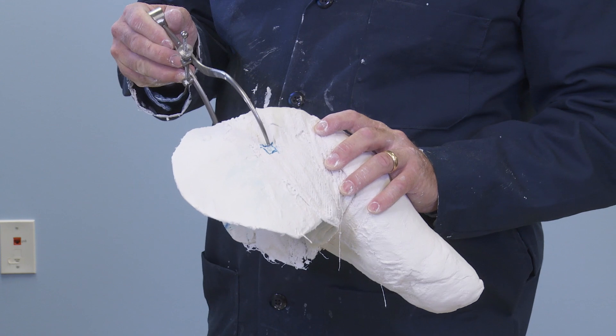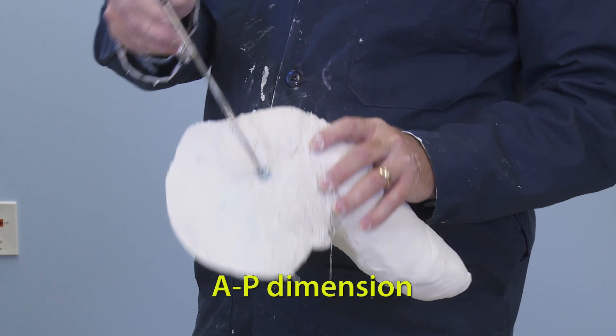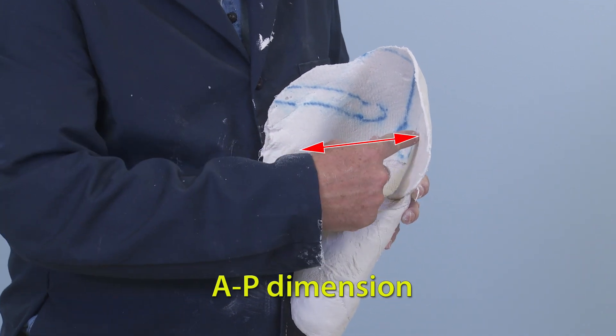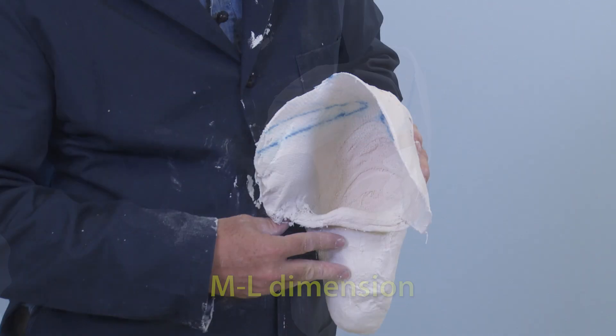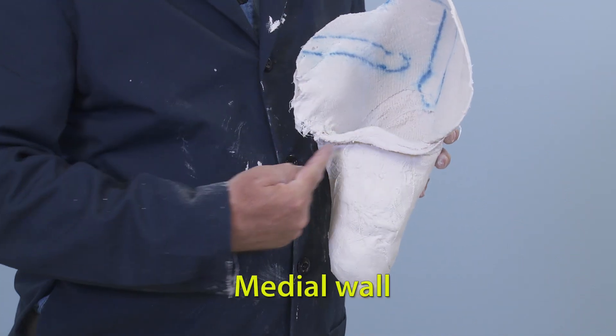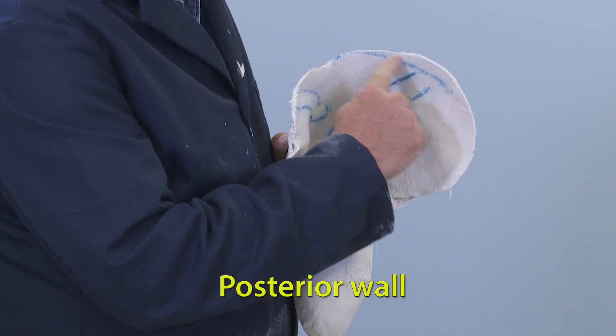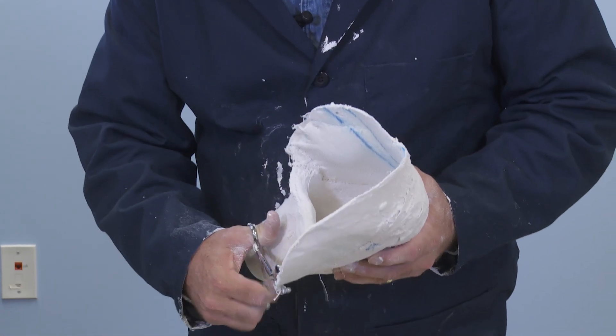Using outside calipers, make sure the mold has not spread. Note the AP dimension, the ML dimension, the W shape of the medial wall, and the posterior wall encompassing the entire scapula. Trim down the mold for ease of filling.